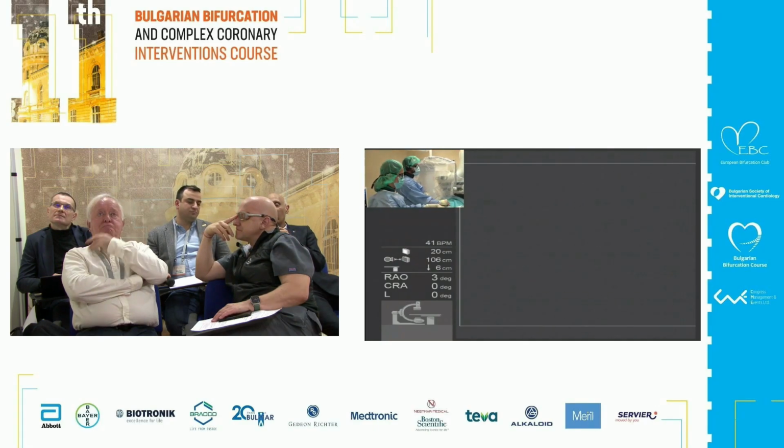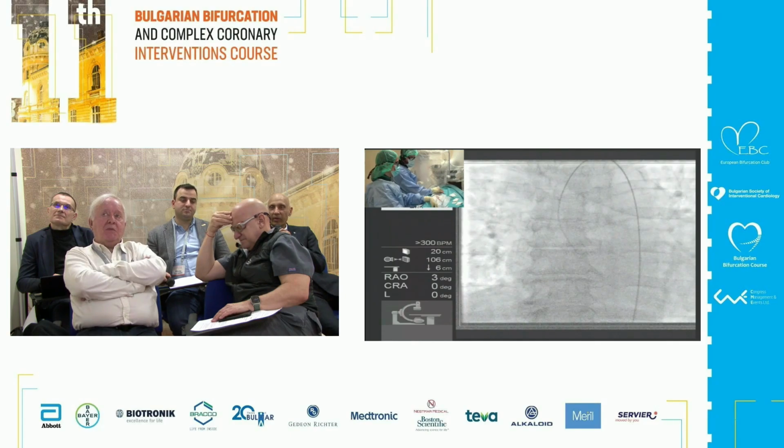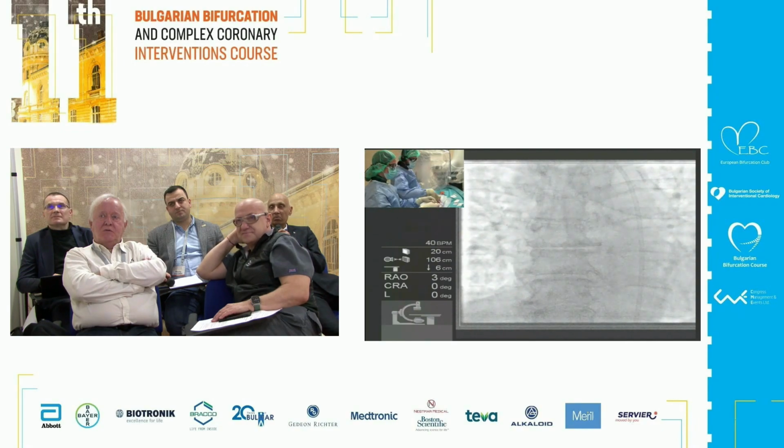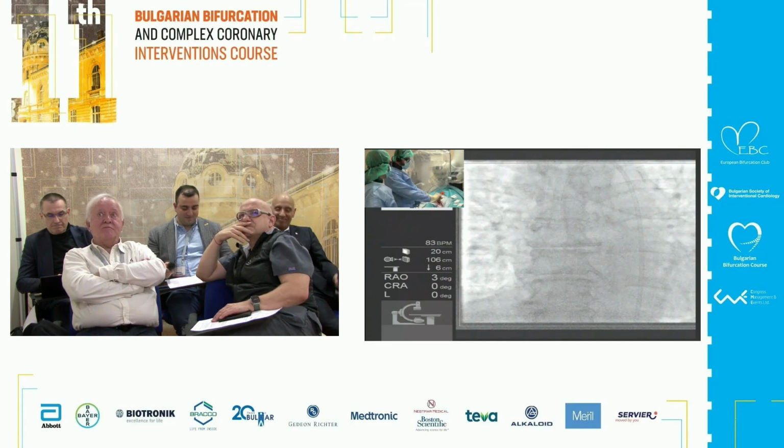But you will know very quickly when it's deep-seated that the EBU is not going to work. You have very little control with that. So maybe Judkins may be better. But I still use, okay, we took EBU 3.5. We'll see how it goes.